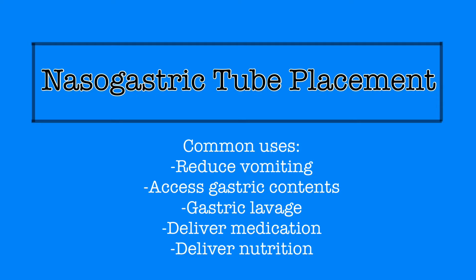Successful placement can be tricky, but many times the biggest hurdle to overcome is that it can be a very uncomfortable and sometimes painful procedure for the patient, which can make things very difficult for the person performing the placement.